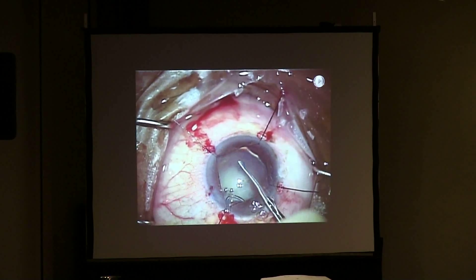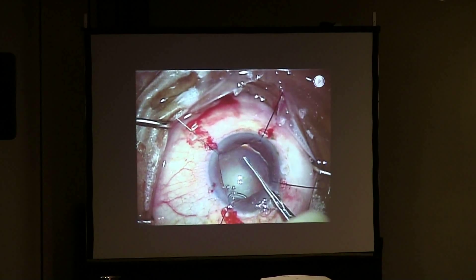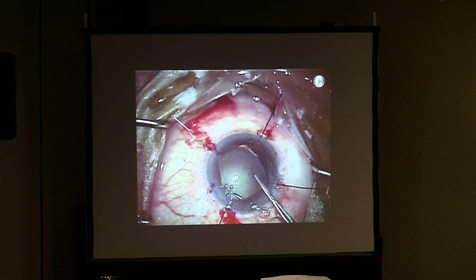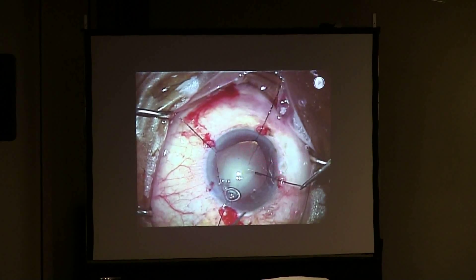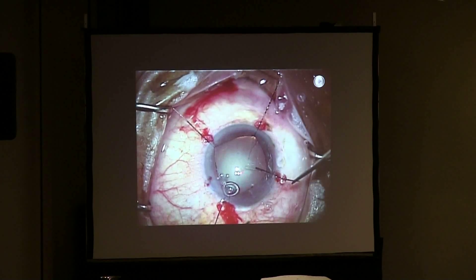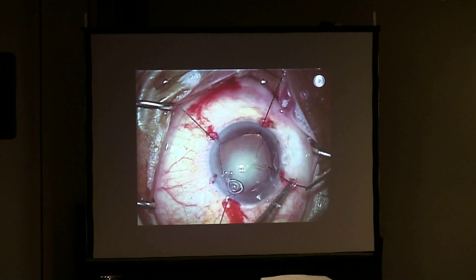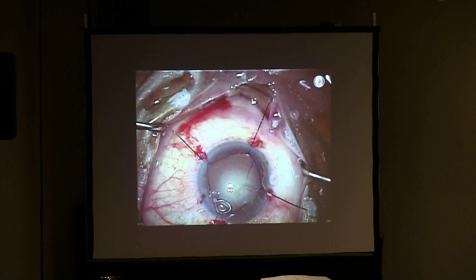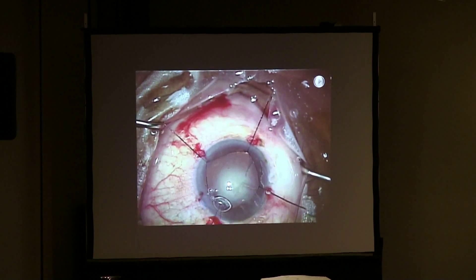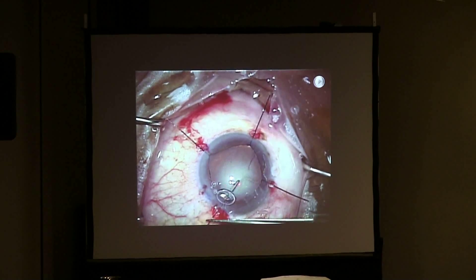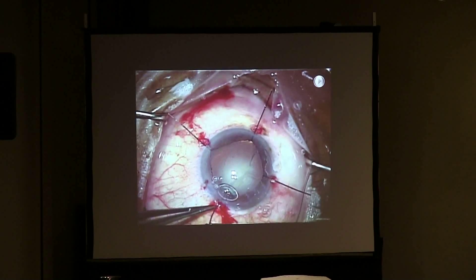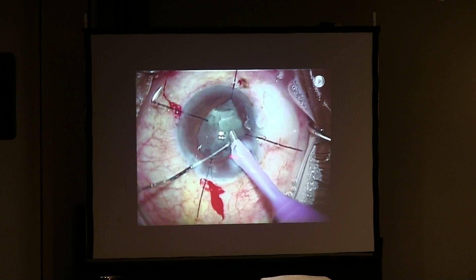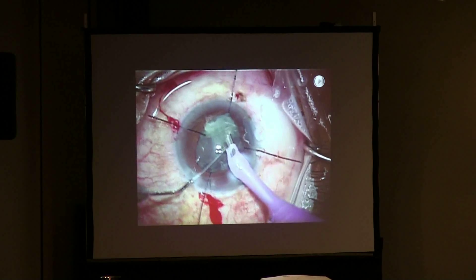I normally do these procedures in the retina room just in case there's a problem. After capsulorhexis, I take my iris retractors and instead of holding the iris, I use them to support the capsule. Then I proceed with cataract surgery. For these traumatic cataracts with significant zonular weakness, I like the pop and chop technique — pop the lens to the anterior chamber, put viscoelastic underneath it, bring it to the anterior chamber, and emulsify it there, minimizing stress on the already-weakened zonules.